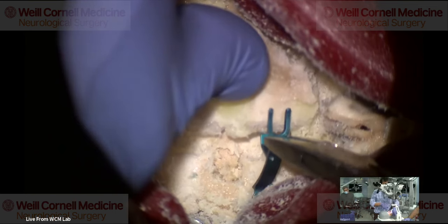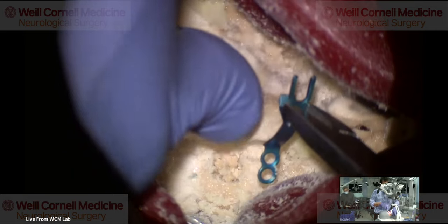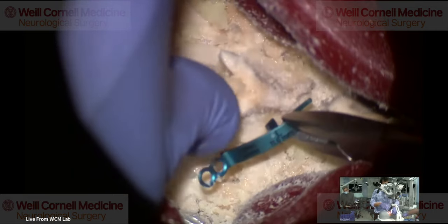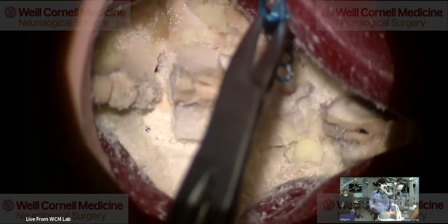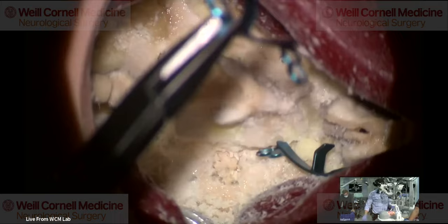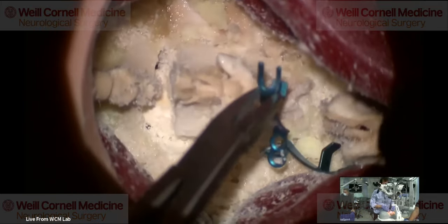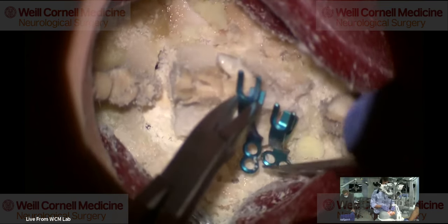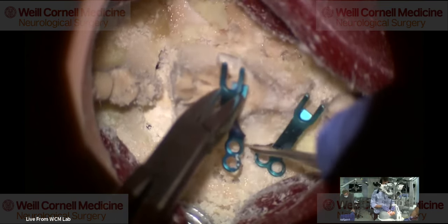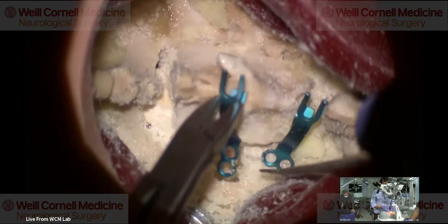And then after that, we put in a plate. Now this is the NuVasive plate, but other plates are very similar. You have two options on these plates. Yeah, this is a different plate from last time. Last time I think I used a Medtronic, I can't remember. It looks very similar, but you have plating options that are either medial lateral or cranial caudal.